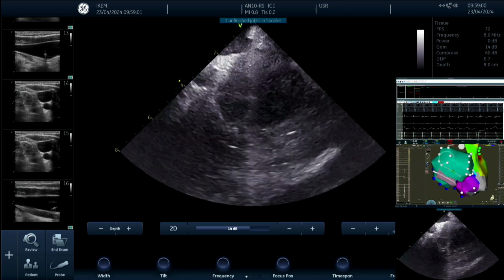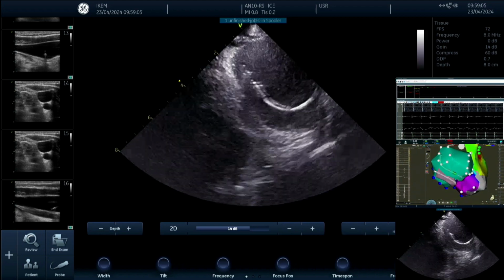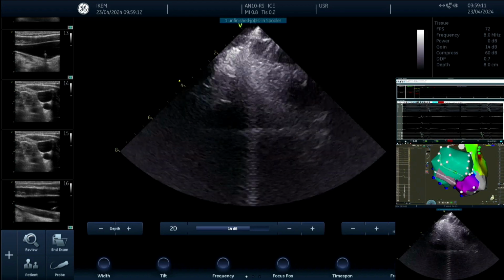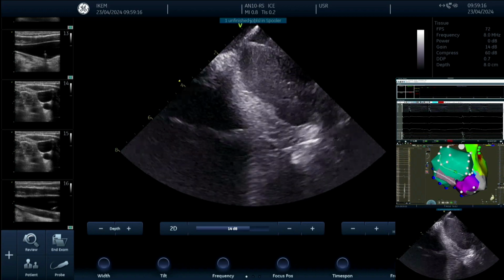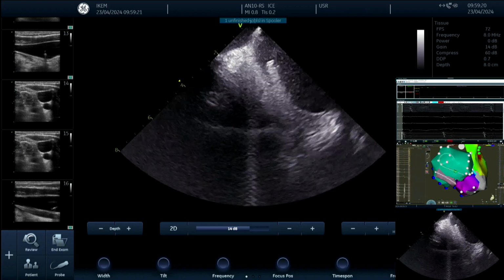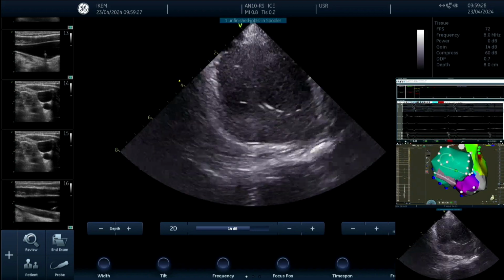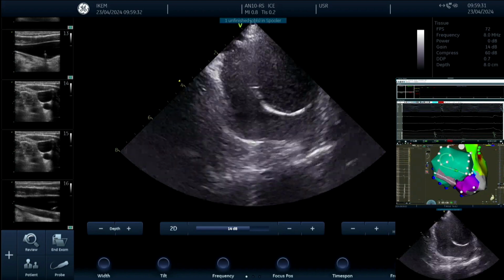So, if I understand, again you will focus mainly on this input to the AV node and the neural input. Would you try not to touch the sinus node? Impossible. No, I wouldn't touch the sinus node because the patient is young and I would like to avoid sinus tachycardia in the future. But sometimes it's impossible, and I hope that it couldn't. But sometimes I have to burn also the higher ganglia.